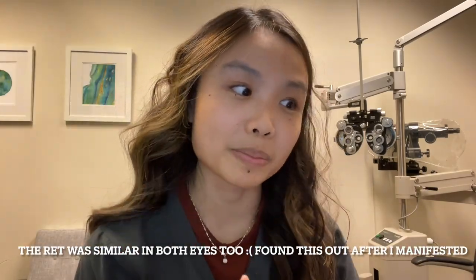So station 3, my poor scoring station. My next tip would be, don't freak out if your ret isn't right, because that's what I did. When I retted my patient, I think I got them down to 20/50 in one eye and 20/20 in the other eye. And in the moment I was like, oh no, this has never happened. I got really nervous because I was aiming for that 20/30 mark so I could just continue. If that happens to you, it's okay. It's really not a big deal. Just give them more minus, give them more plus, take out some, add some, just so you can get them down to like 20/30, and then you can continue.